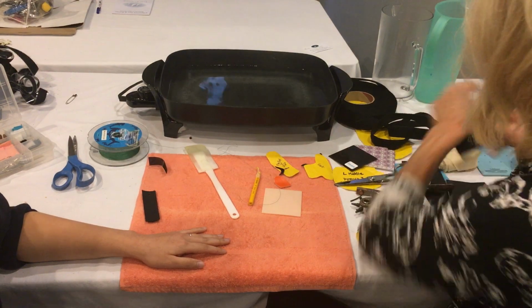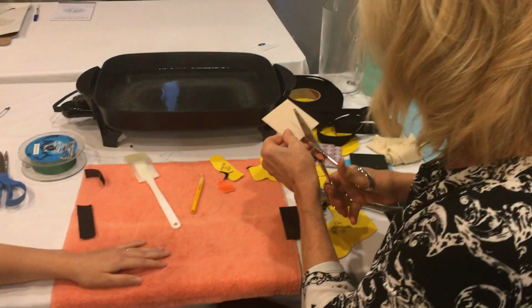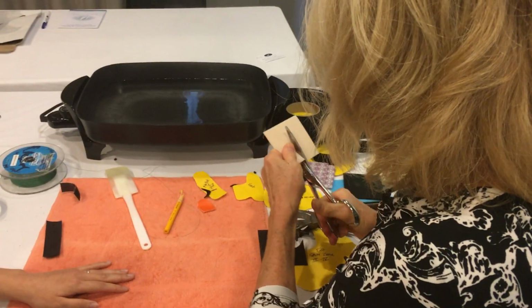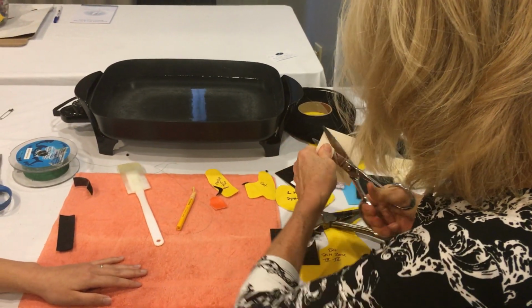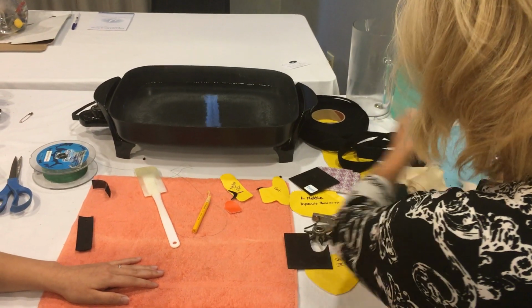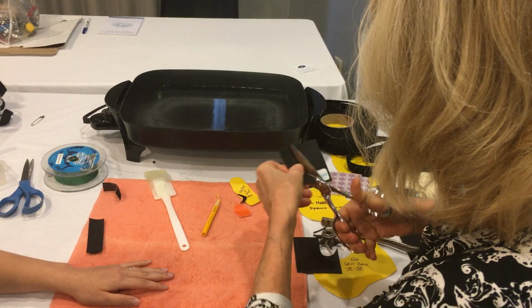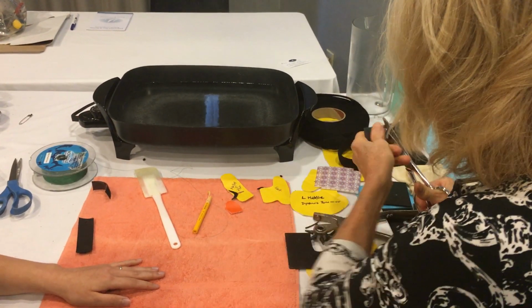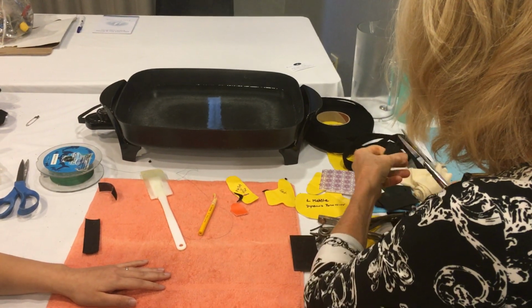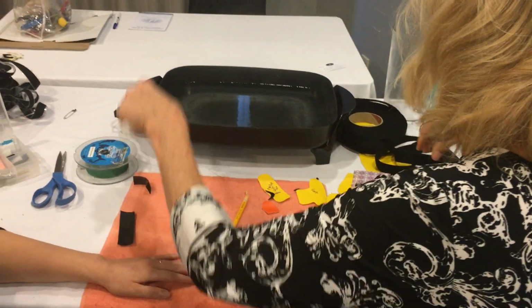Meanwhile, while that one's heating, I'm going to make the other splint design that I like to use. Actually, I don't want to use that material. It feels like it's 3/32, and I want a 16th inch material here. Should be ready now.